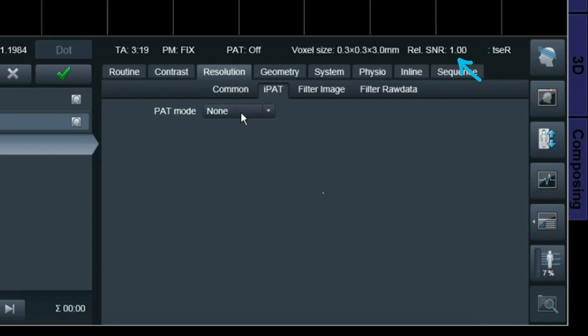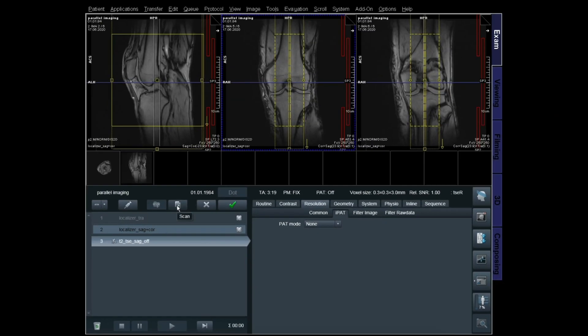Remember, whenever you save your protocol or scan and open it again, it will say 1.0 — it's just a relative indicator. It's a very helpful tool for knowing which parameter affects the SNR, whether you're gaining or losing signal. Currently we have 3 minutes and 19 seconds for this scan, so we're just going to run it.